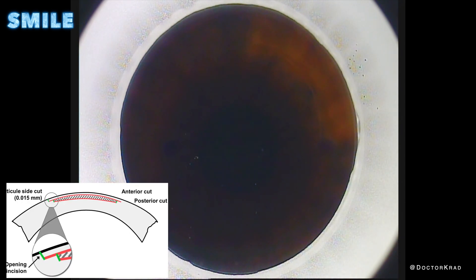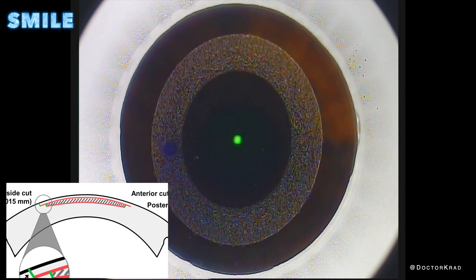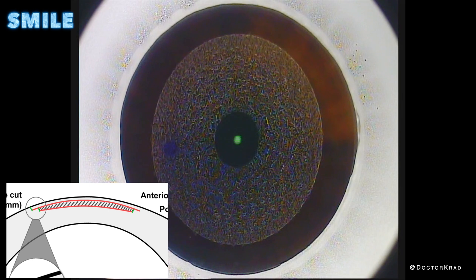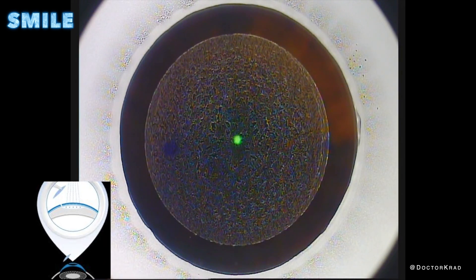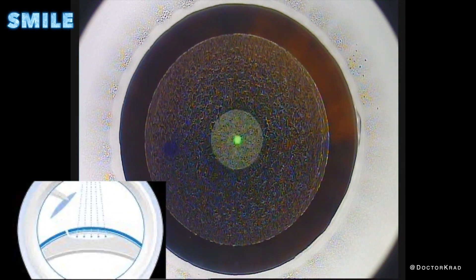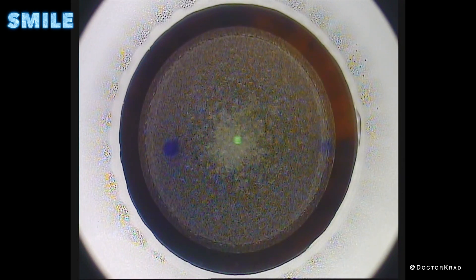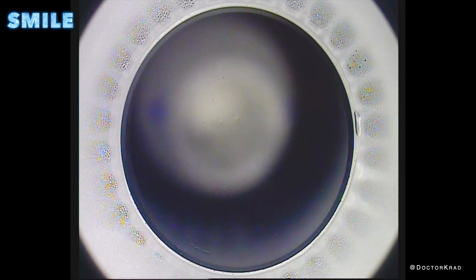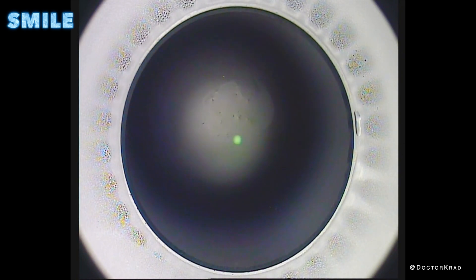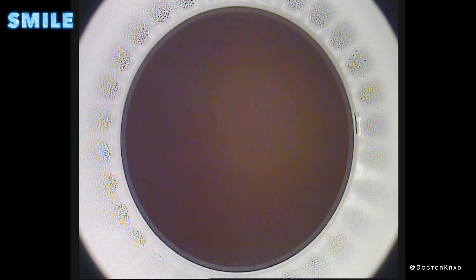The laser creates two planes of dissection: the deep one or posterior layer, which it's creating right now, and then it creates a second plane of dissection in front of or anterior to the first plane. Together, you've created this disc or frisbee-shaped amount of corneal tissue that you can remove. The white haze you see is a sheet of air bubbles within the cornea. On the bottom of the screen is a white arc, which is an incision that allows us access to remove the disc of tissue. Now the suction from the laser is automatically turned off, so the laser portion is completely done, and we are going to position the microscope to remove the disc of tissue.